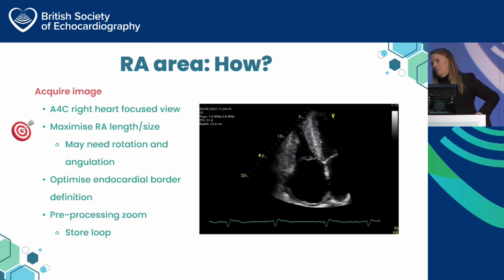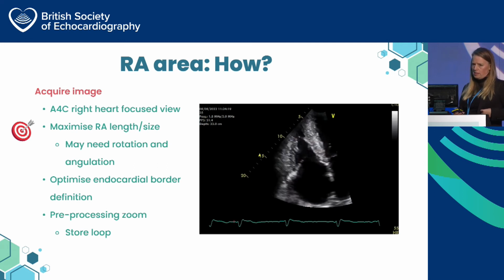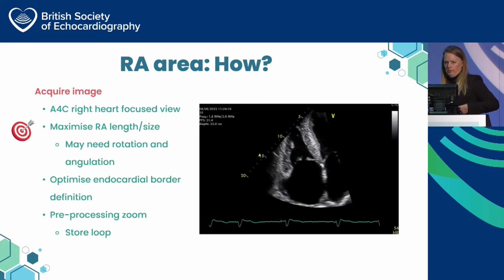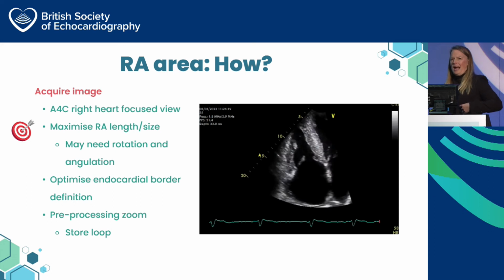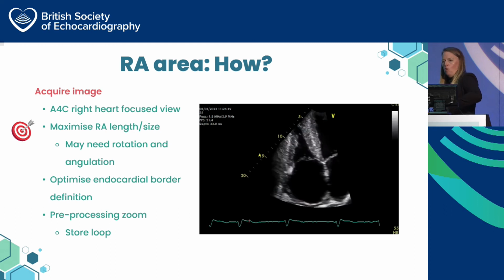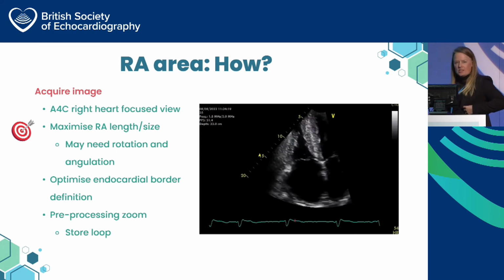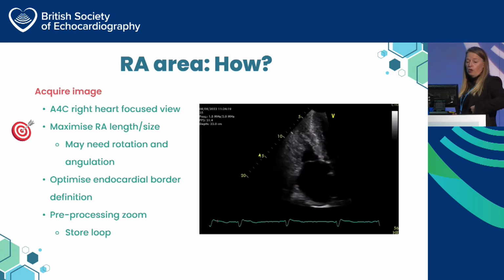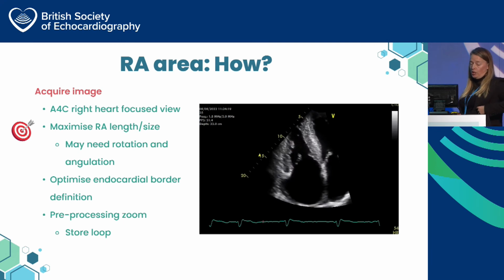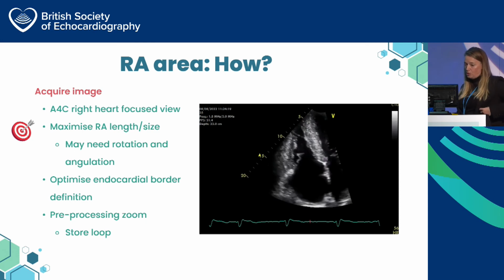My tip there, if you're a trainee, is that often you don't need to move the probe from where it is on the chest. I don't know if anyone's talked to you about heel-toe rocking of the probe. Sometimes when we say, oh, angle more this way, it's hard to understand what that means. But if someone says, just put a bit more weight on the heel or the toe of the probe, it helps you understand which way to tip it. So here what you need is more weight on the heel of the probe, so you're angling a bit more medially in the patient's chest. In some people, you do need to slide a bit more laterally, but not in everybody. It's sometimes just that small movement.